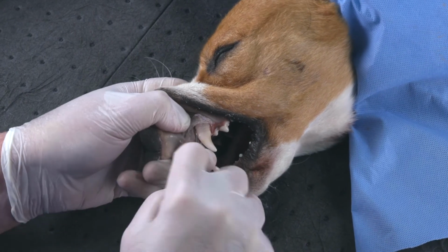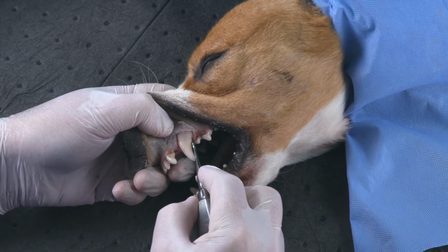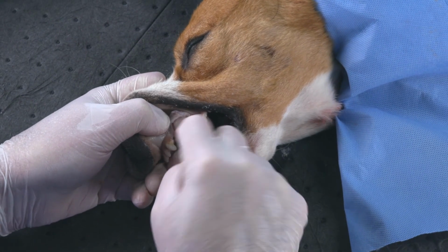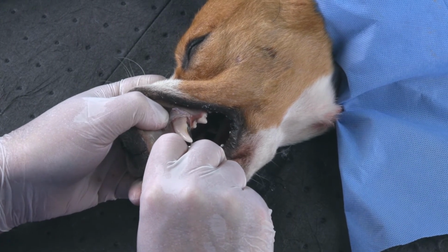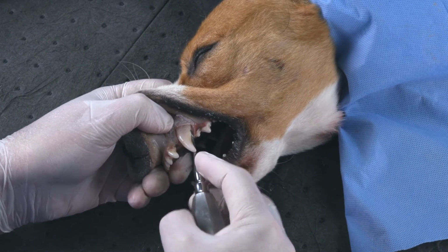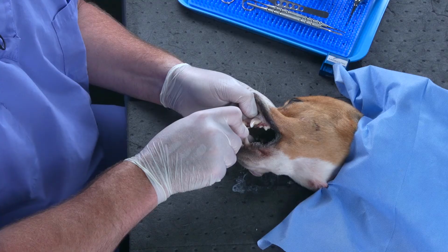Once we've worked on the mesial aspect of the tooth, we can withdraw the instrument and go to the opposite circumference down the distal aspect of this tooth. I'm working my elevator deeper and deeper down toward the apex, cutting periodontal ligament fibers, applying twist and hold, allowing the periodontal ligament fibers to fatigue and driving the elevator even deeper down in between the root and the bone.